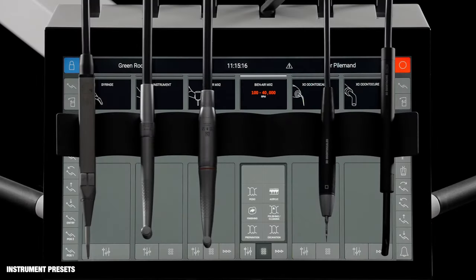A unique feature of ExoFlow is the option to work with instrument presets, where all instrument settings are optimized for the purpose of performing one specific task. Each user may work with the standard presets that come with the unit, or create his or her own presets.